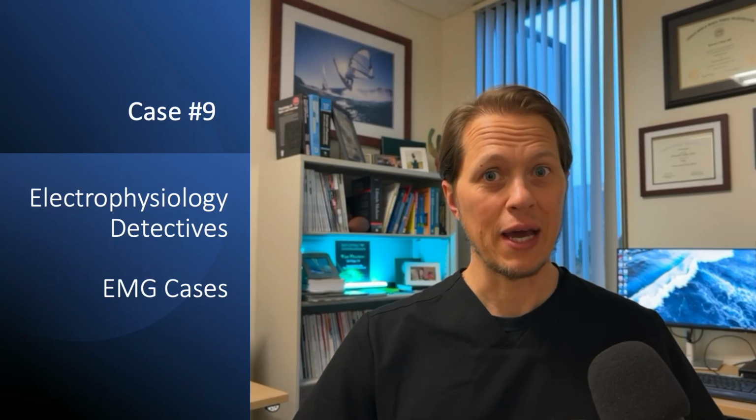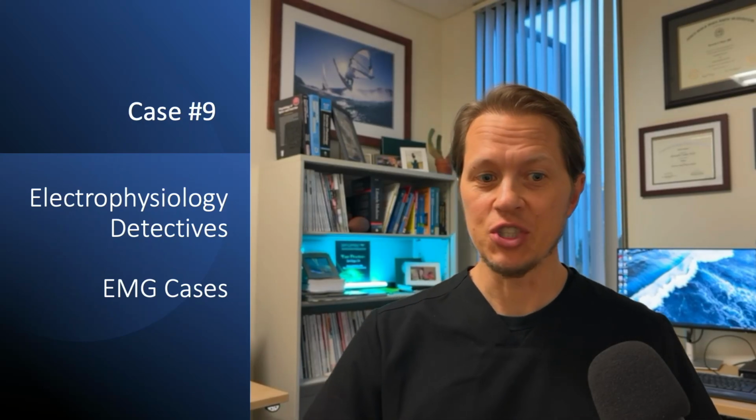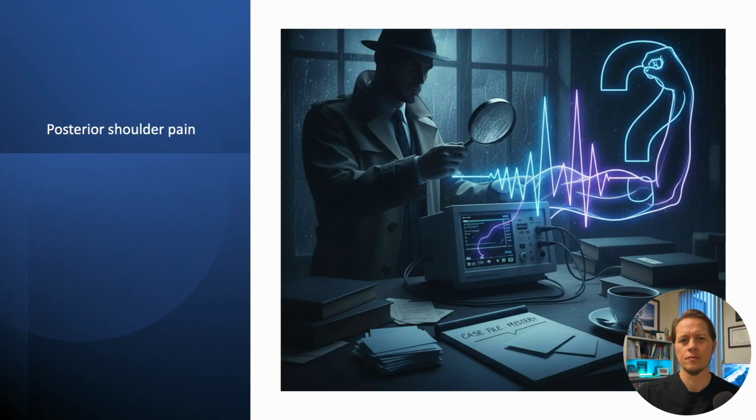Hello everyone, welcome back. It's been a while since we've done an EMG case, so let's get started. These are fun because we go through the case, I present the data first, and we work backwards with differential diagnosis to try and build your clinical acumen.